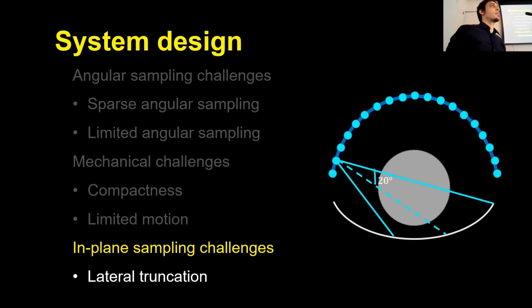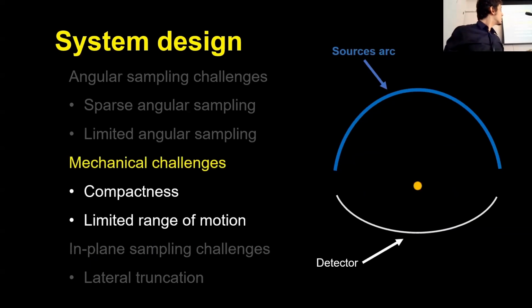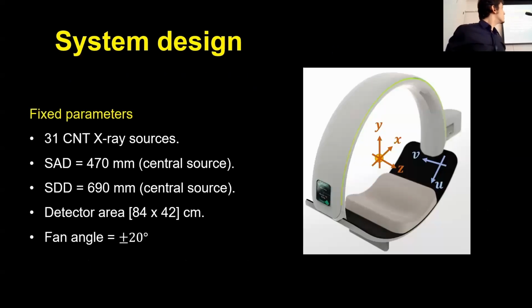Hi, you claimed at the beginning that the system has a smaller footprint than other systems, but you never gave any evidence of that. There are mobile C-arm CT systems that are very small. And moreover, I don't know if you know the system by Medphoton in Austria. There's the imaging ring, which is basically a ring of the diameter of your blue arc around the patient, and it contains the X-ray detector and one X-ray source, and it calculates basically 360 degrees of data.